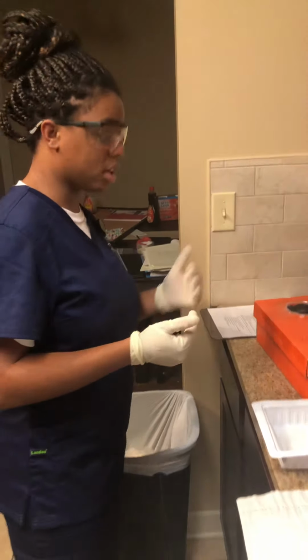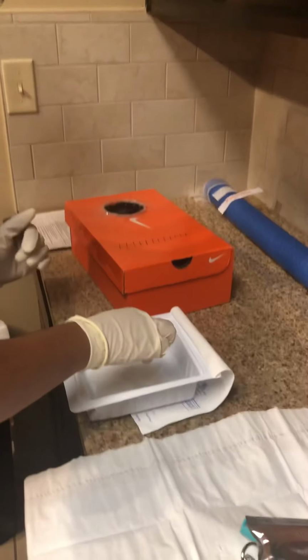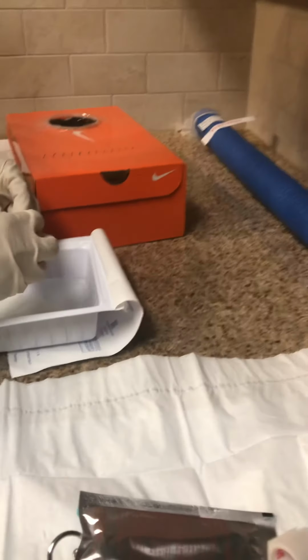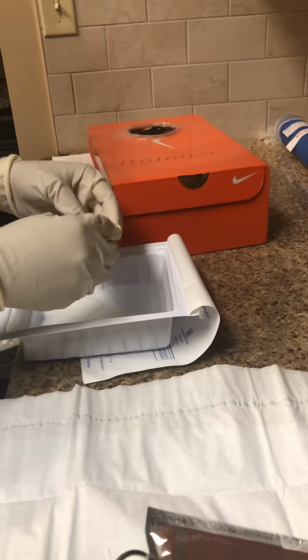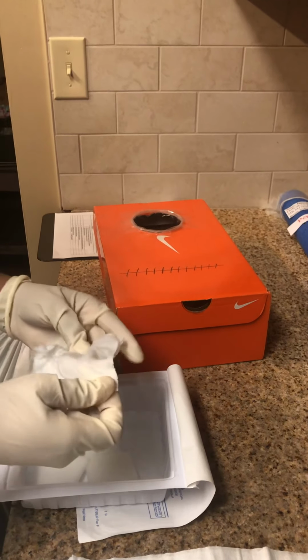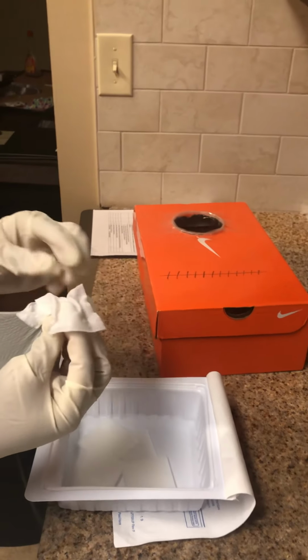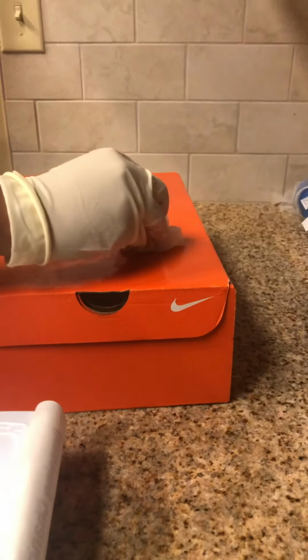I will now begin to clean my suture from less contaminated to more contaminated. I will grab a gauze. I will wring it out without splashing. Now I will clean the inside of the suture with one stroke and then throw it away.